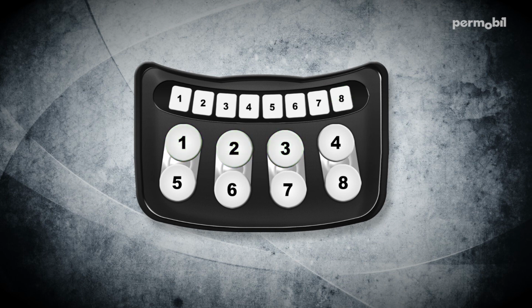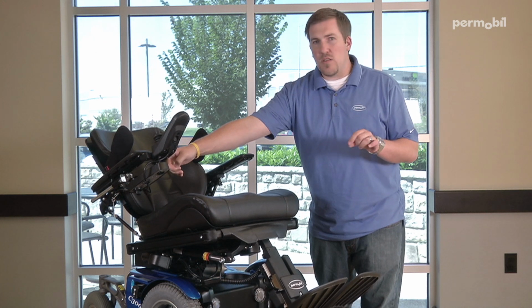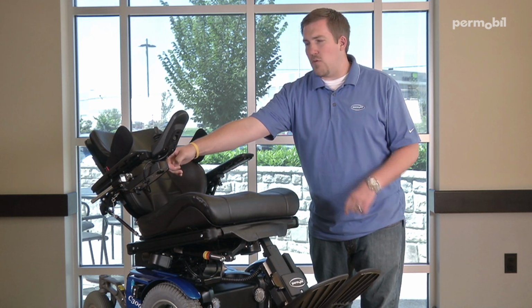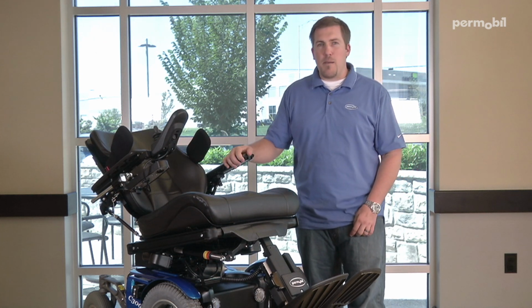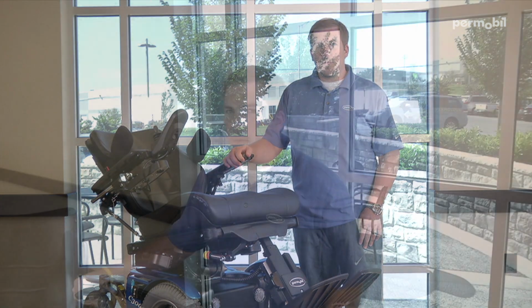The position that we saved earlier in position 1 can be recalled by pressing and holding button number 1 on your switchbox. The actuators will run together, usually at the same time, until that desired position is reached. Once that position has been accomplished, you'll notice that there's a little green LED that will light up above that button, indicating that you have reached that desired position.